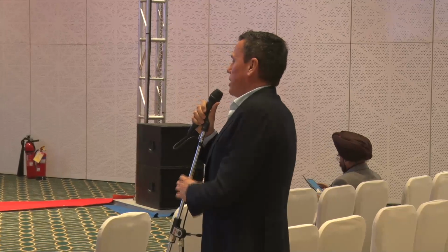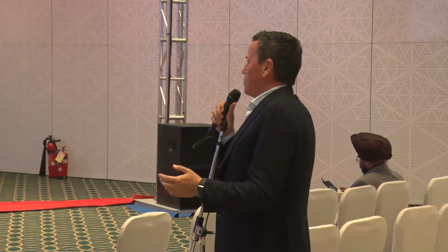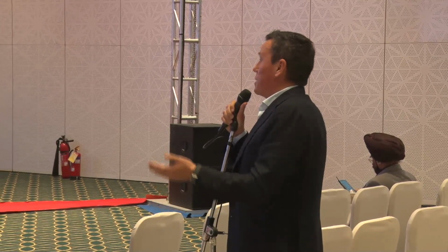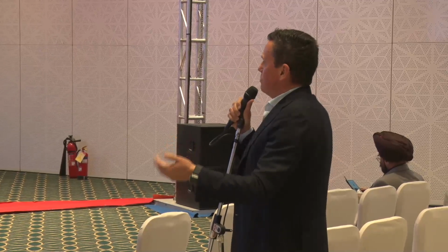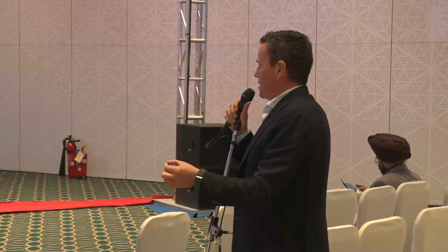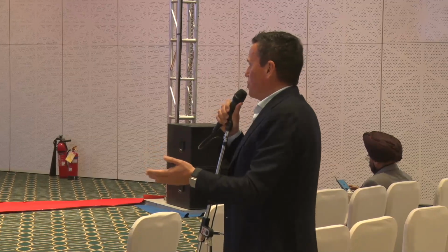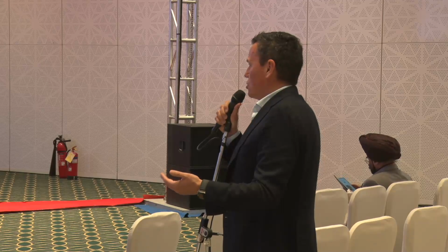So I developed the laser formula with 150 eyes implanted in my practice. And it was a good comment of Dr. Shetty saying that it was based on the Caucasian eyes, of course. And when we look at the Nakamura formula, it's based on Asian eyes. And there the size of the implants of the ICLs was mostly 12.1 and 12.6. Whereas in my series it was 12.6 and 13.2 with a mean of 12.9. So we are asking STAAR for quite some time to develop a 12.9 ICL size.